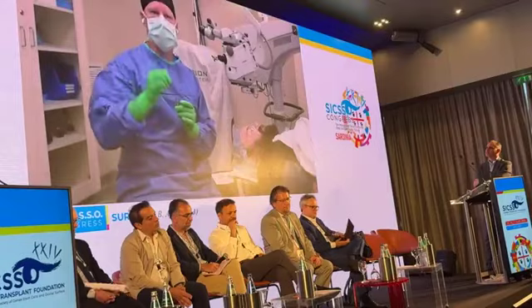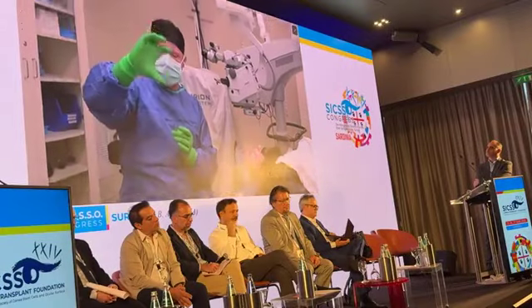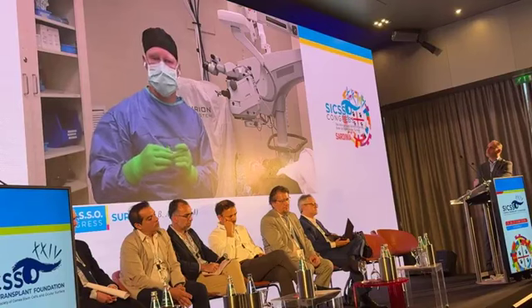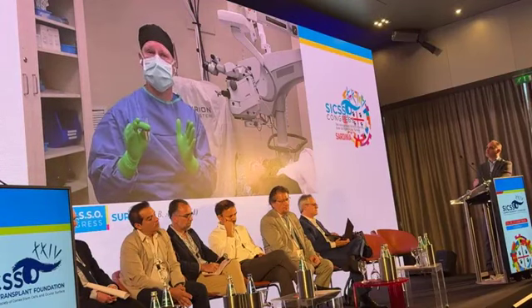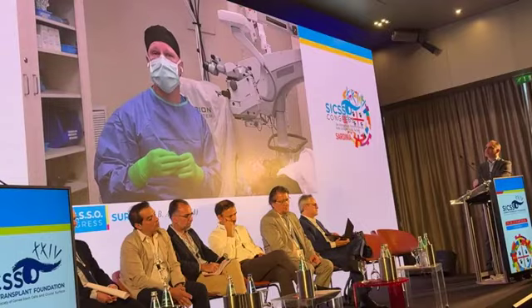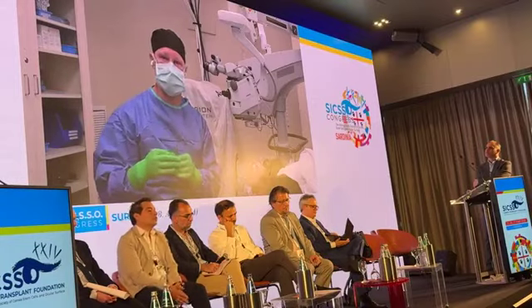Yeah. So you can see this is a 4 mm offset mark. They've got all these different distances, 3.75. And you basically just mark down and over. So you mark down and over from the pupil center, and that tells you where to recenter the treatment zone for the channels. It's a little bit harder to explain than it is to see on the map itself, but that's all done prior to going to laser, at least here. Some people can actually do that under the laser.